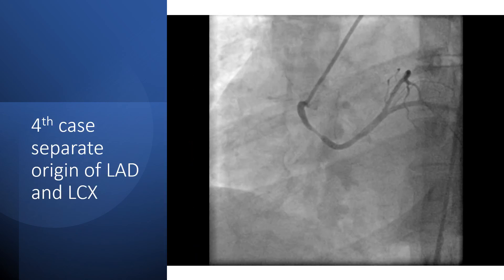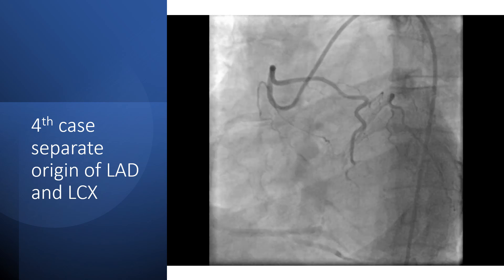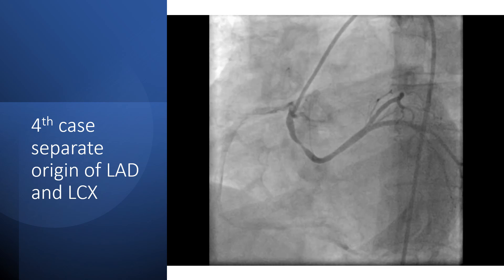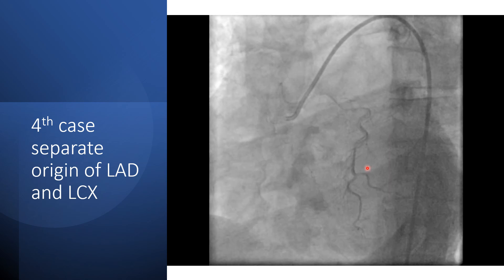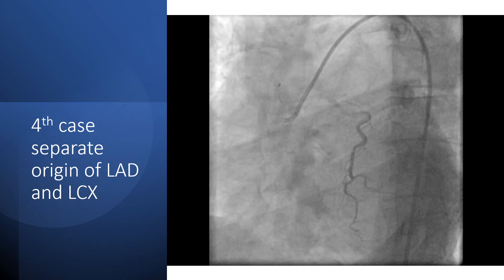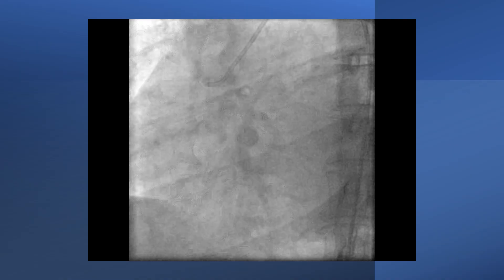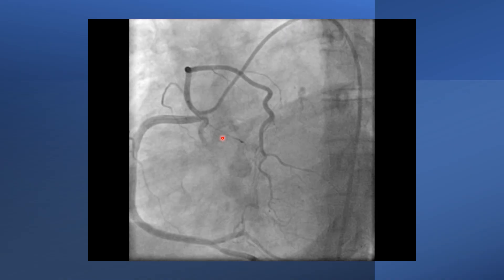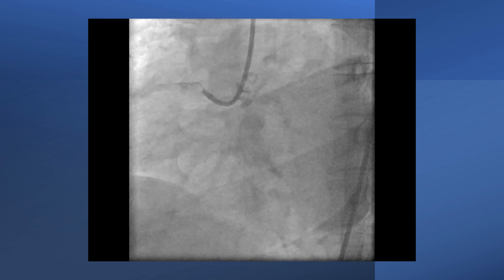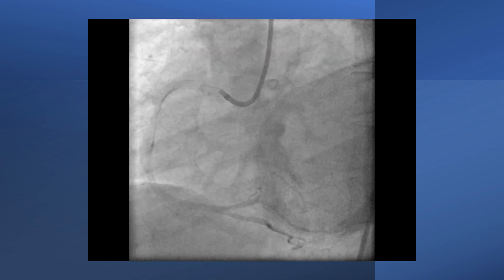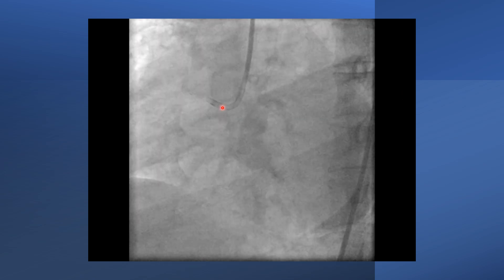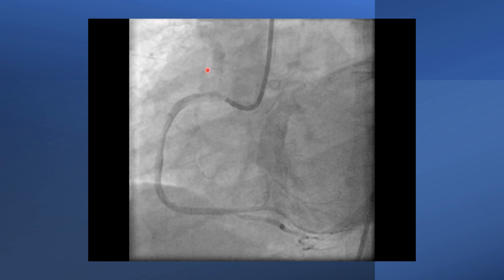In another case of left main from the right, the circumflex and the LAD have separate origins. This is the circumflex, and here is the LAD. This is the same case with selective engagement of the LAD. In this view, we can see all three arteries: the RCA, the circumflex, and the LAD.